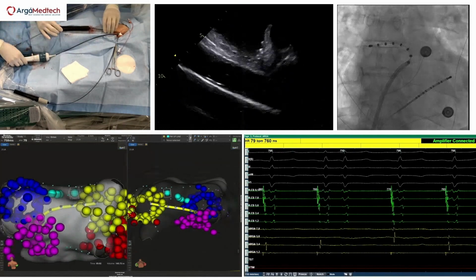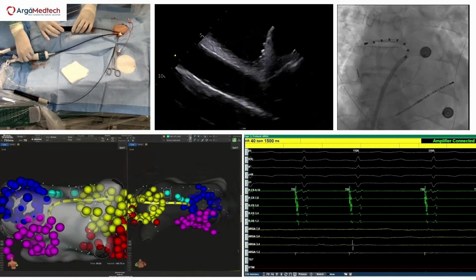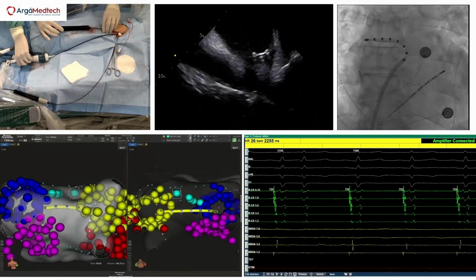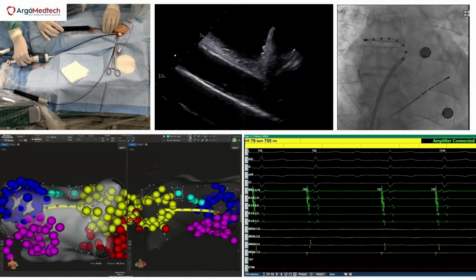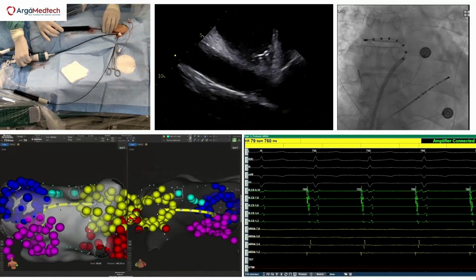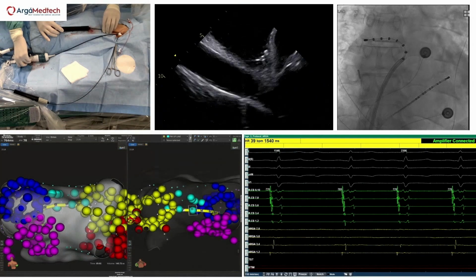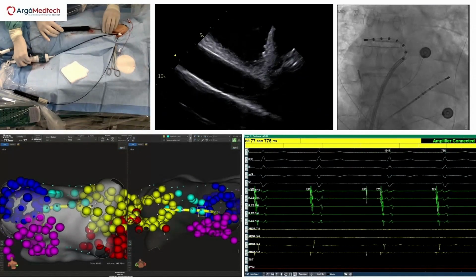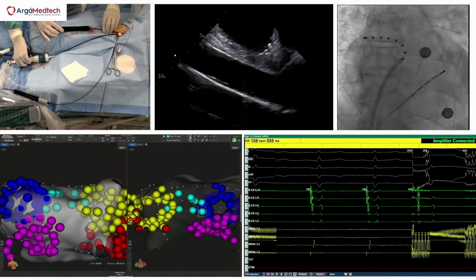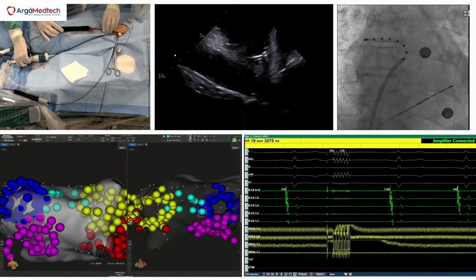Now, let's try and see how we can bring this. You see now, I can do a double line. Let's say, Tony, thank you. So now I can fire 2, 3, 4, 5, because I believe 2, 3, 4, 5 are in contact. 2, 3, 4, 5 max. Go. Fantastic. Tony, I think you appreciate that the central part has a good contact.